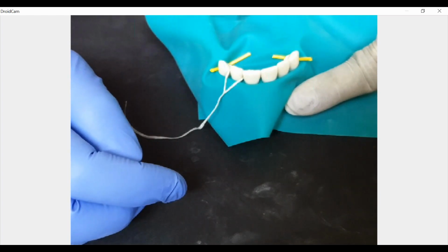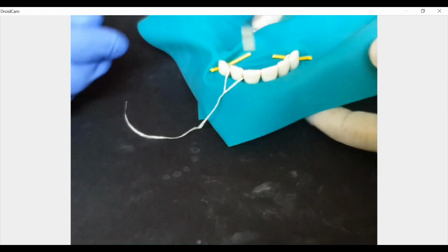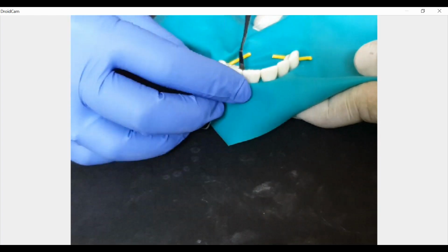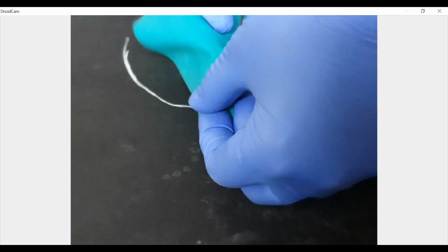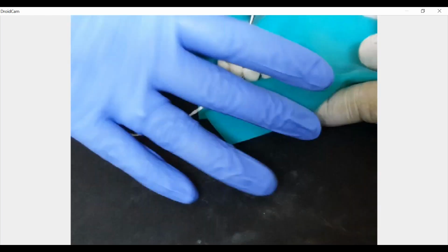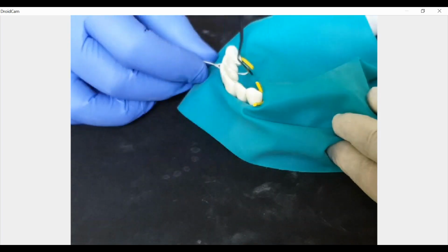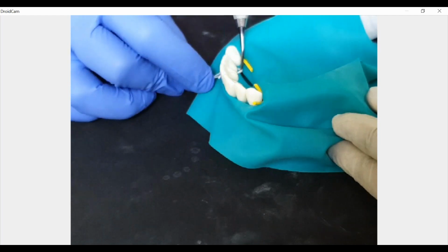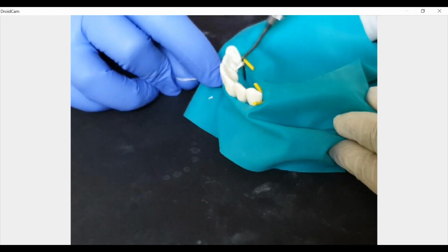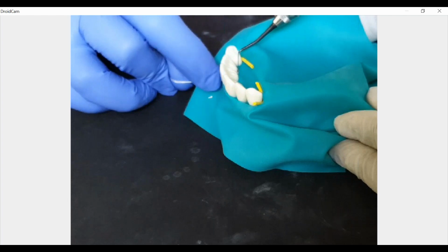rubber dam inversion. Again, I will use this end of my plastic filling instrument to engage it. So you will know what I'm doing. So you see, I have engaged it and I'm gently pulling the floss tie. When I do that, the floss tie will get exactly to the place where it has to, along with it taking the rubber dam sheet. And you can see that I'm tightening it from this side.